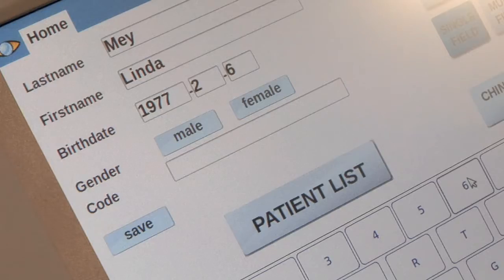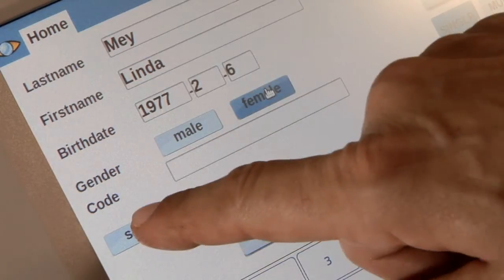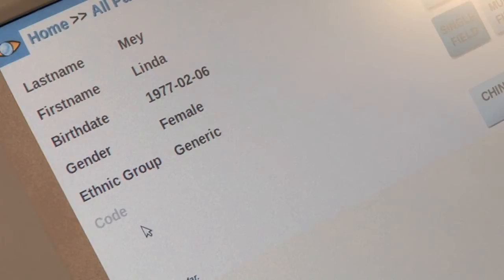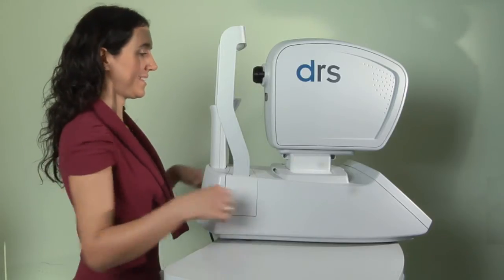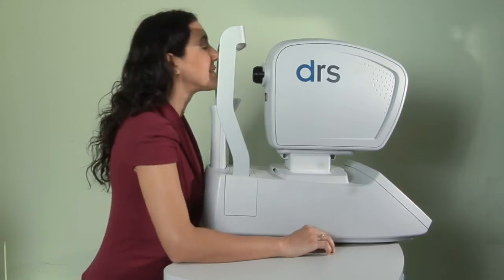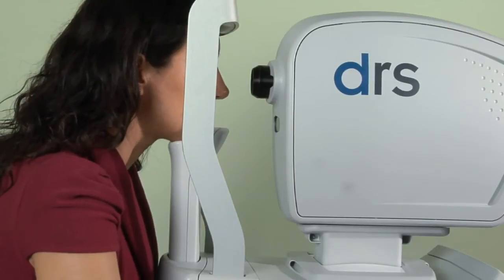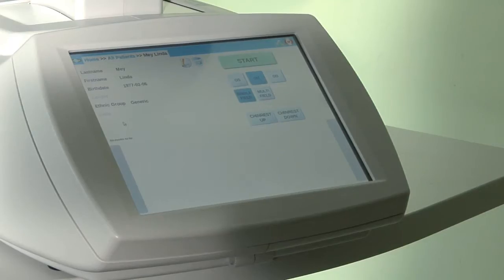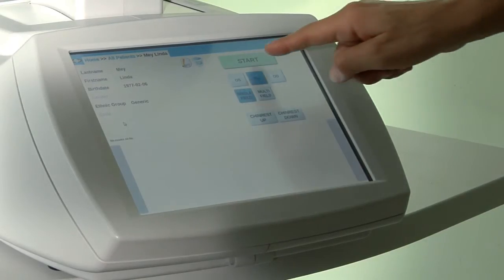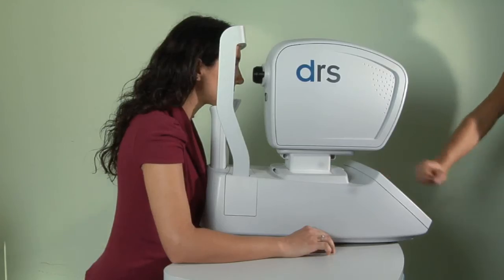All you have to do is insert the patient's name and her or his data. Simply have your patient sit comfortably in front of the DRS and have the patient rest her or his chin on the chin rest. Then press Start.